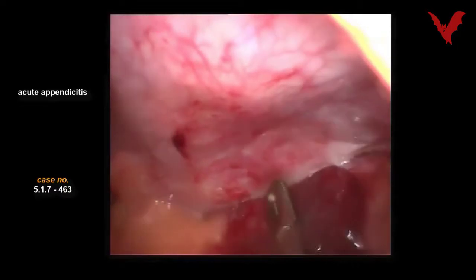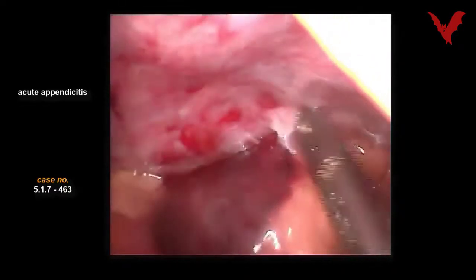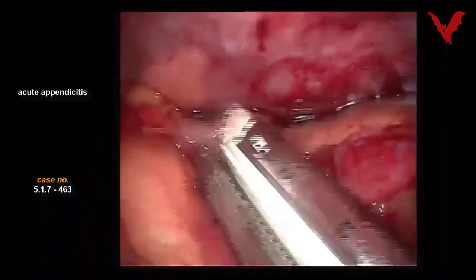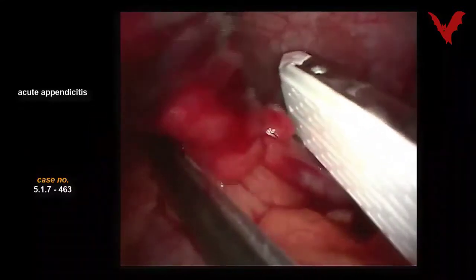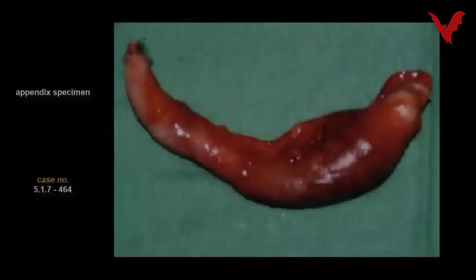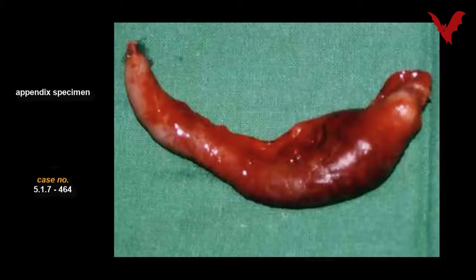Case 463 briefly demonstrates some steps of laparoscopic intervention until the extraction of the specimen, and the typical specimen of a laparotomy is shown in case 464.